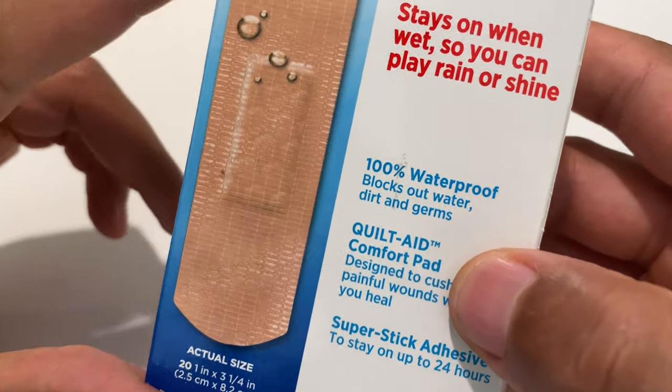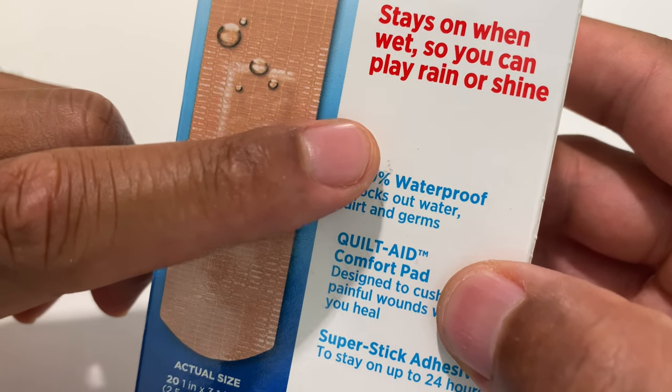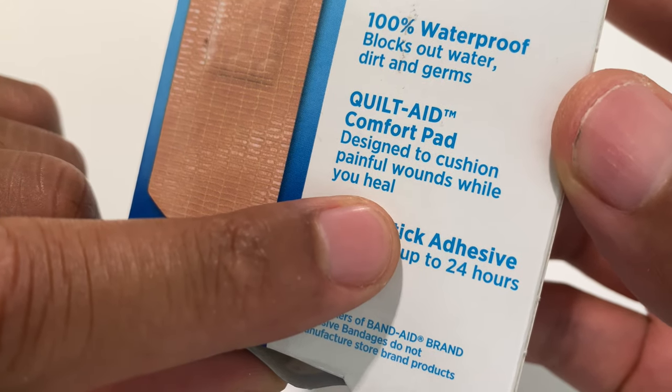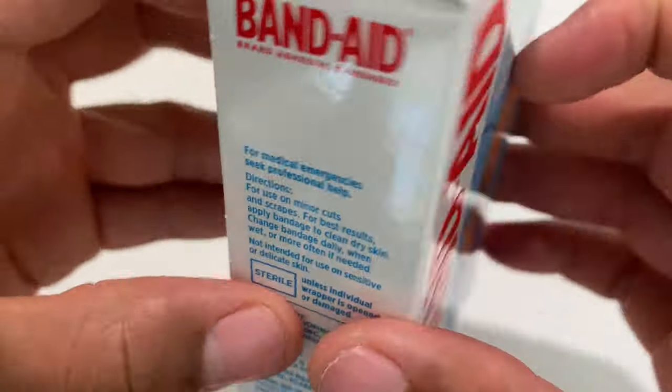On the back it says stays on when wet, so you can play rain or shine — looking forward to that. It also features a quilt aid comfort pad designed to cushion painful wounds while you heal — looking forward to that. So let's go ahead and open this up.